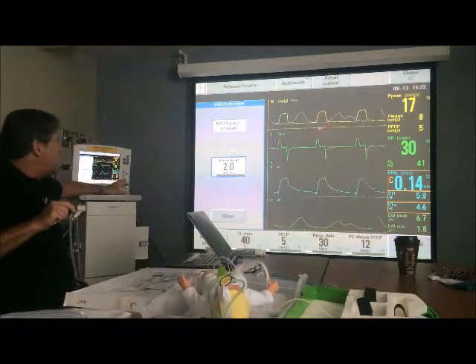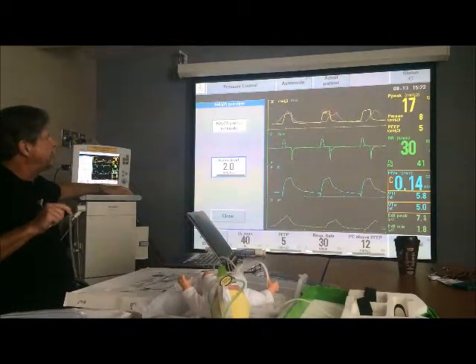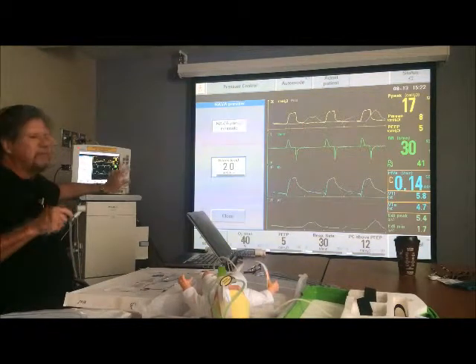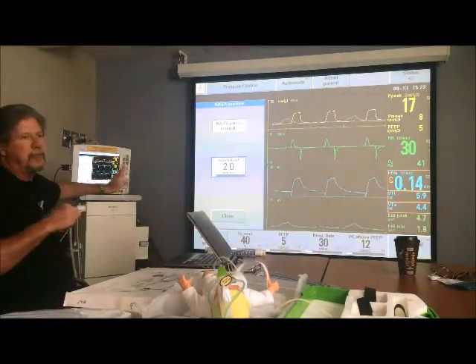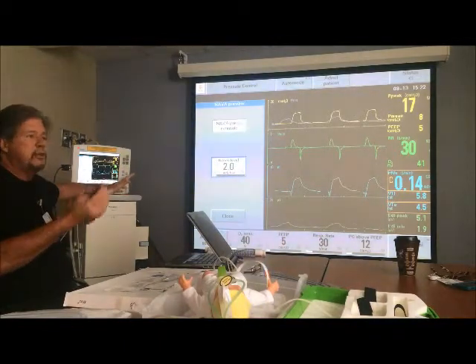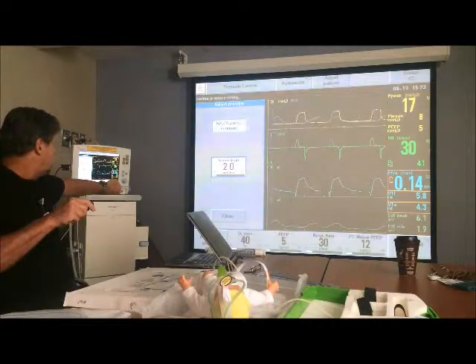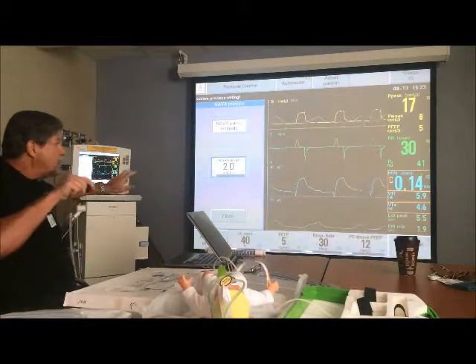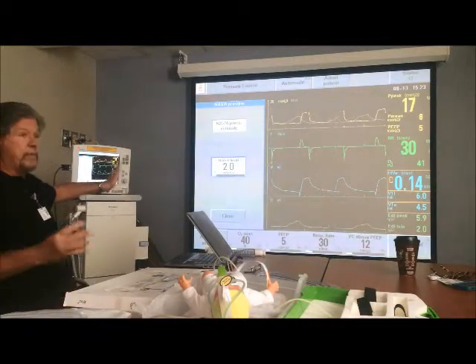So I'll set my NAVA level initially at 2 and then watch it and say, okay, I would have delivered a little bit more pressure. In that case, I would have delivered a little bit less pressure. That one is about the same. So I'd look at this for a number of breaths and say, okay, if I start NAVA at a NAVA level of 2, for the most part, he'll be getting about the same pressure that he's currently getting. And so consequently, his tidal volume will be about the same, and the baby will be happy.